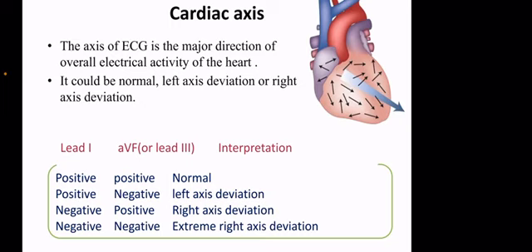If it is within this axis, this is normal axis. But if it goes beyond this, it is called left axis, right axis, and so on. Okay.